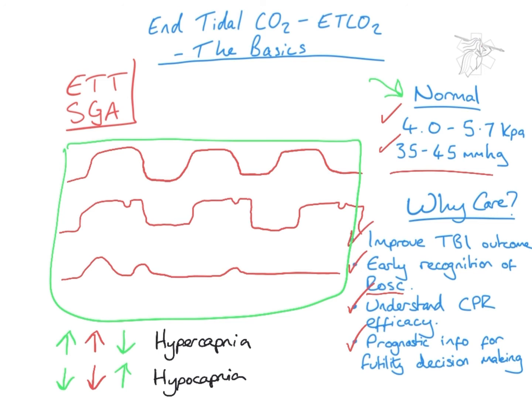So I'll just annotate this a little bit better for your reference. So green would be end-tidal CO2, and red is your ventilation rate in response to the end-tidal CO2, and obviously it's moving that way, so hopefully that helps. So that's it, whistle-stop tour of end-tidal CO2.